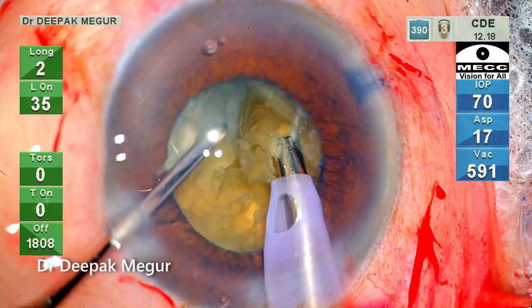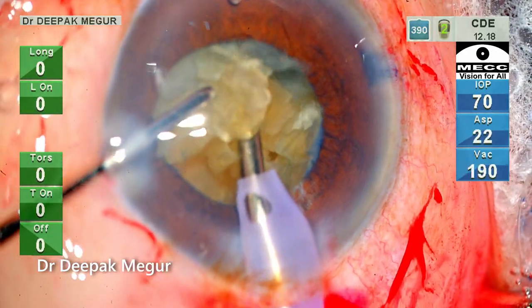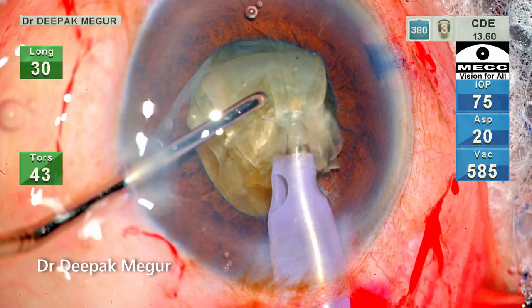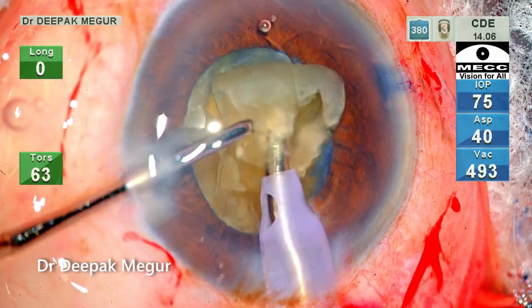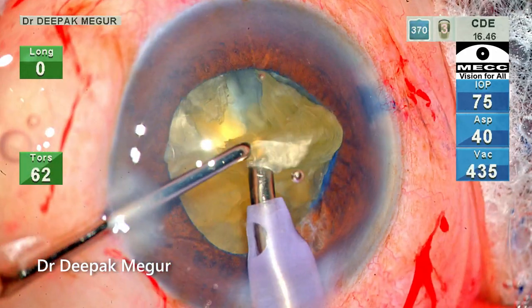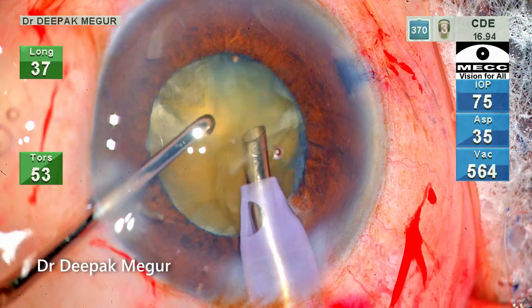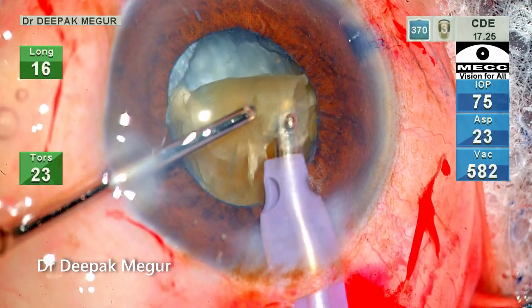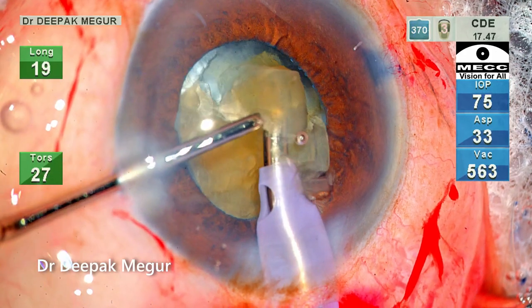Once the first two fragments are free, I prefer to emulsify them in such cases where the rhexis is discontinuous. The reason is, obviously, emulsifying these pieces creates more space in the bag, and this is of great help as it minimizes the stress on the weak torn anterior capsule during further nucleus division maneuvers.